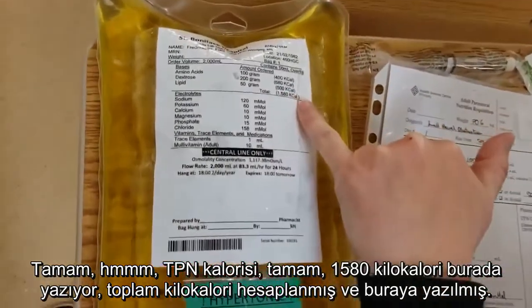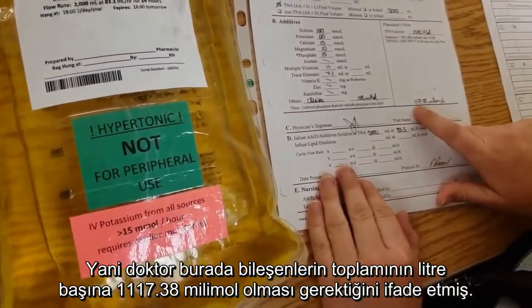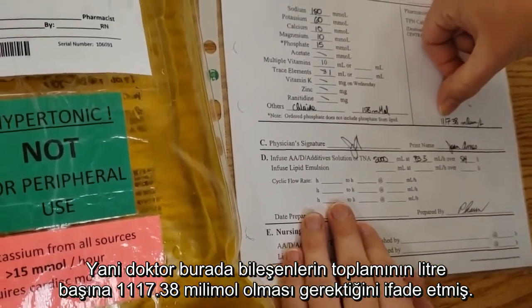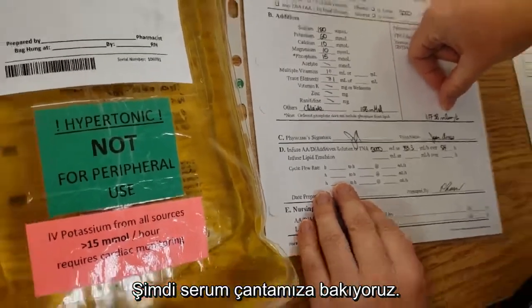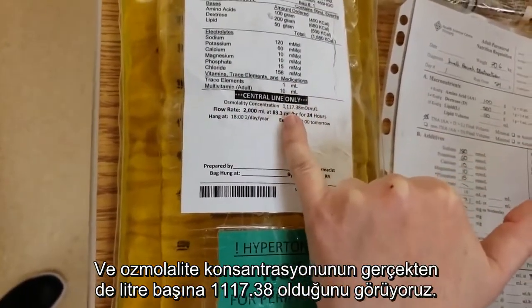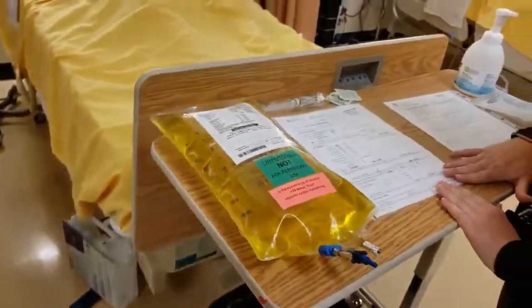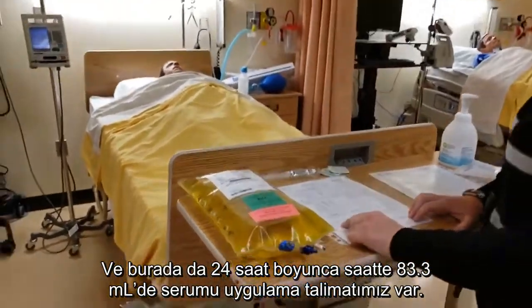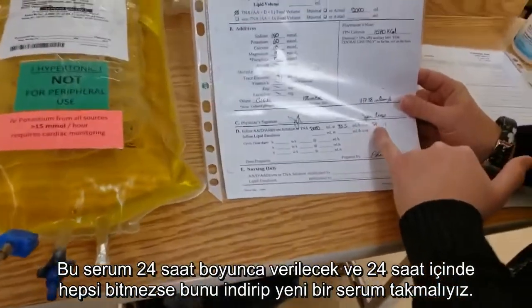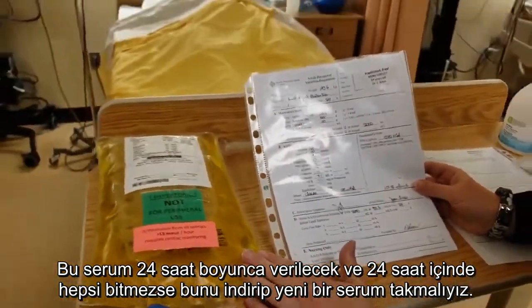Down here is the total milliosmoles per liter of our components. The physician has said that the total of these components should add up to 1117.38 milliosmoles per liter. We come over to our bag and find that the osmolality concentration is indeed 1117.38 per liter. We've got our physician signature and we're happy with everything. There's an order to infuse it at 83.3 mLs per hour over 24 hours. This solution is good for 24 hours — if it's not all infused within 24 hours, we just take it down and get a new bag.